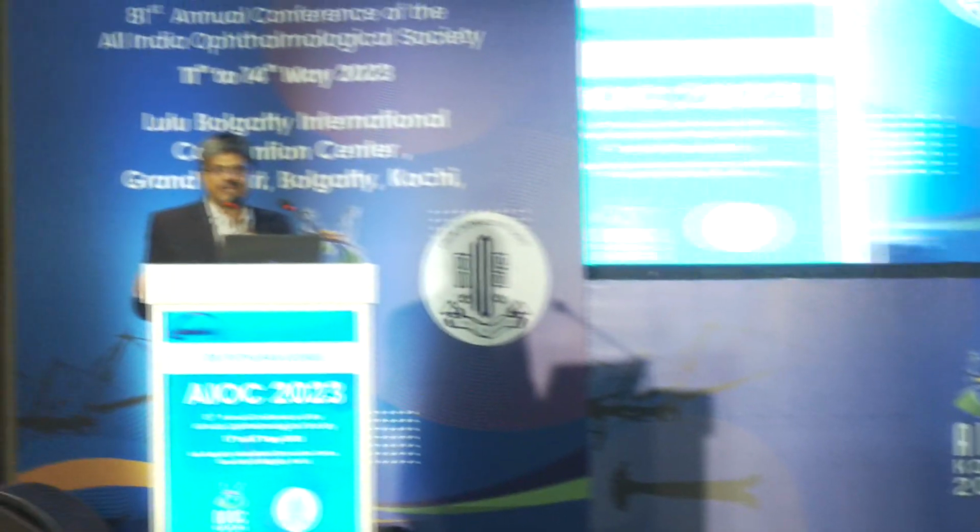We have had plate exposures, very few, 1 or 2, which are usually in post retinal surgery eyes or multiple surgeries where we've had difficulty in the conjunctival dissection. I think the quadrant of placement and conjunctival health are the most important factors for plate exposures. Luckily, we don't see much of plate exposures. We had to explant. It's very difficult. You have to find ways on your own to ensure that.